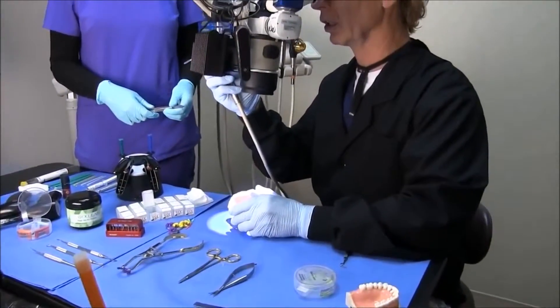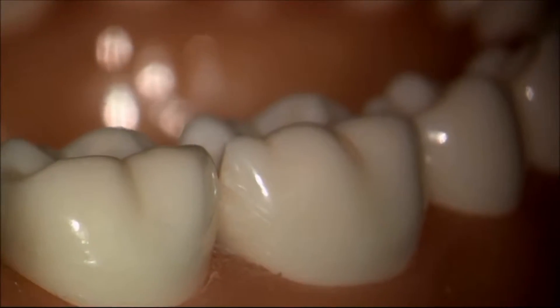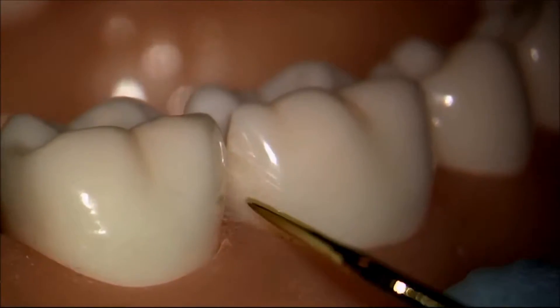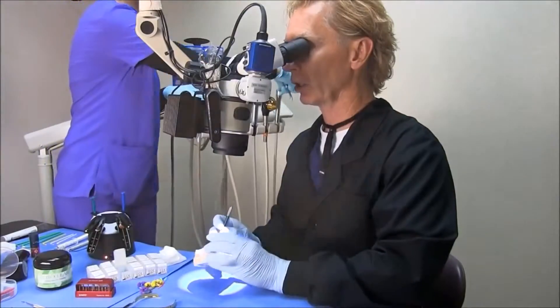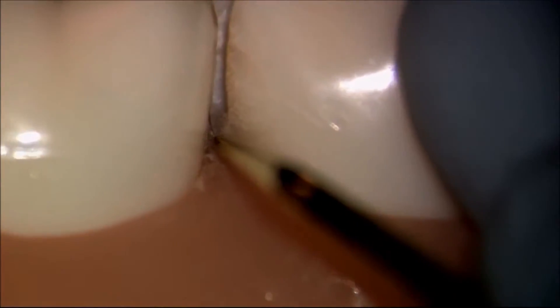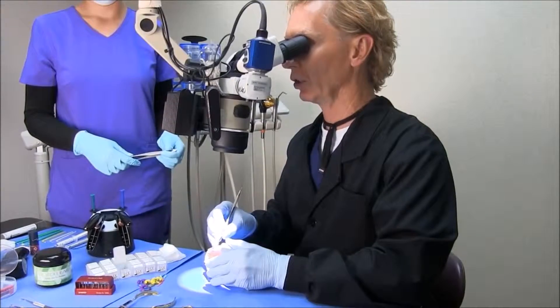You'll notice that the entire surface has now been sanded all the way to the line angle. As we do our injection molding, we're going to allow the composite to truly wrap the tooth and engage all of that enamel — and especially the enamel at the gingival.